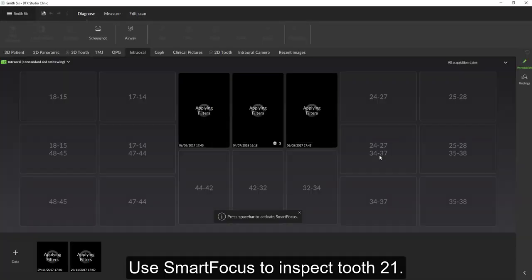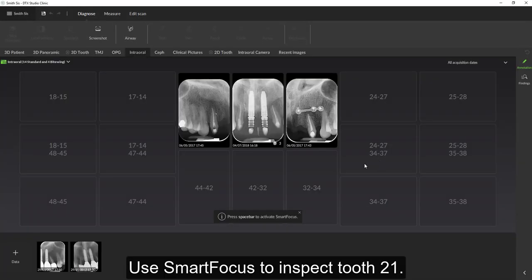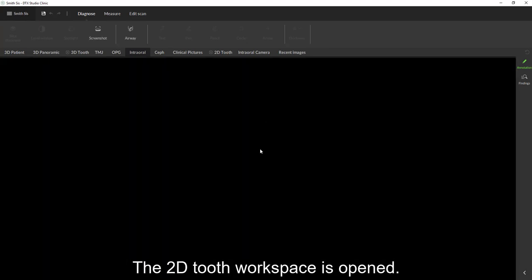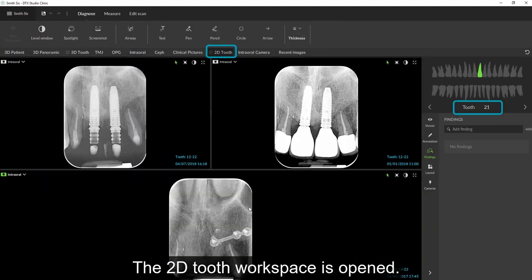Use Smart Focus to inspect the upper left center incisor. The 2D tooth workspace for this tooth is opened.